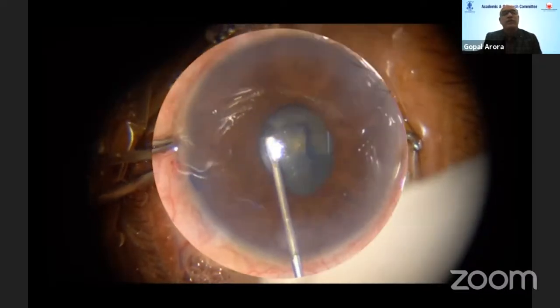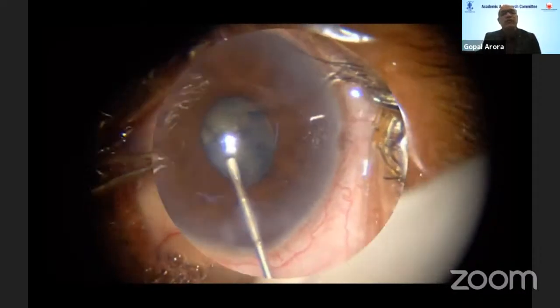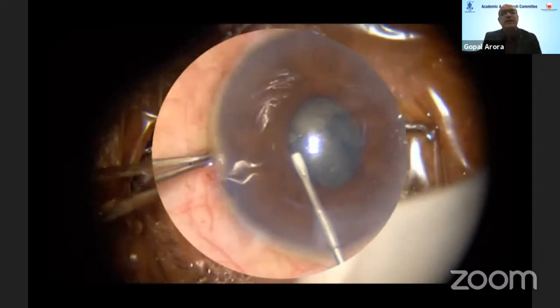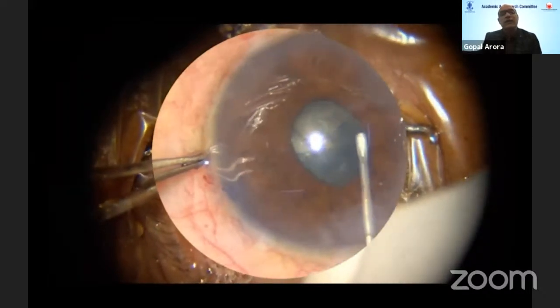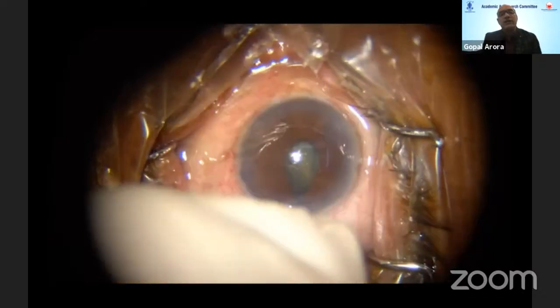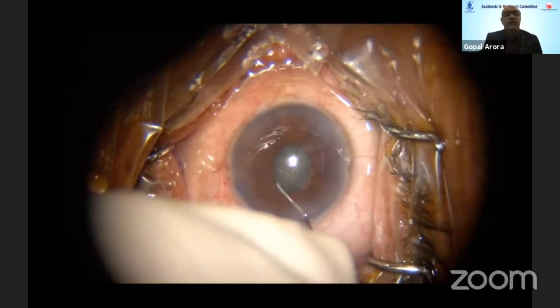You are doing rhexis on a blind procedure, but at the same time, you must be sure that the rhexis is not going towards the periphery. As you can see very well, the shearing technique which I'm using gives me a fair idea that the rhexis is not extending to the periphery.